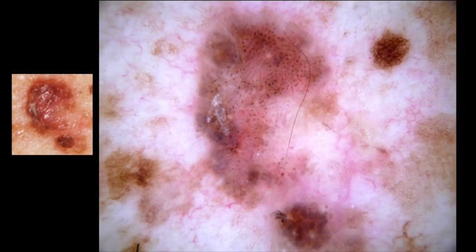Another lesion. You look at it, and instantaneously you know this is bad. Your first thought is going to be, that's melanoma, and you're going to biopsy it, which is totally fine. But if you look at it closely, notice these dots again, brown dots, in a linear fashion here, and you say, aha, that's probably not a melanoma, that's probably a pigmented squamous cell carcinoma. So that's the feature. And yet another squamous cell carcinoma with these little brown dots that have somewhat of a linear arrangement.